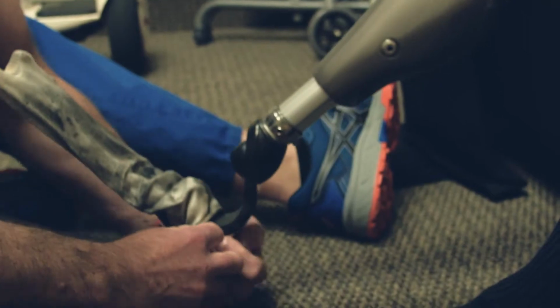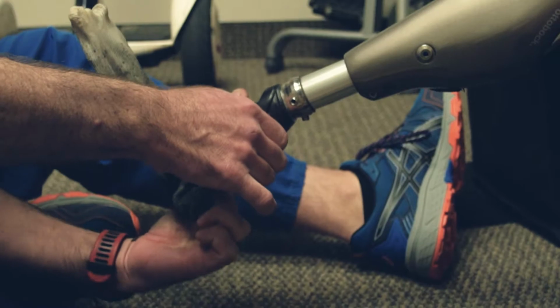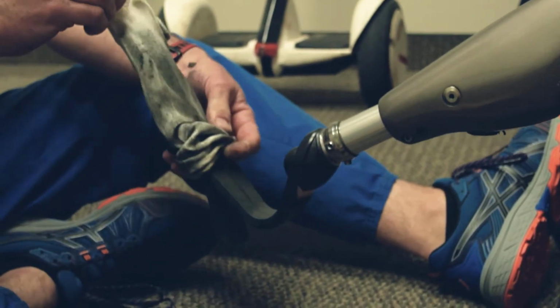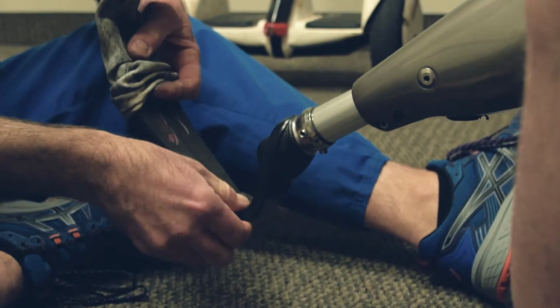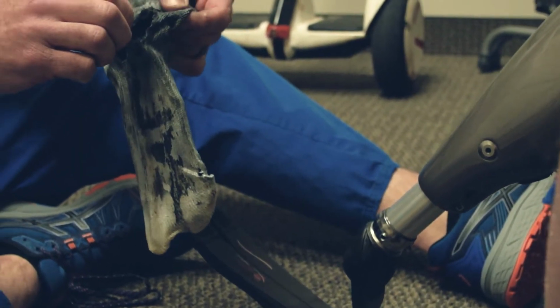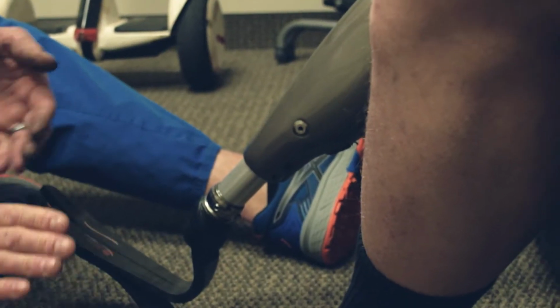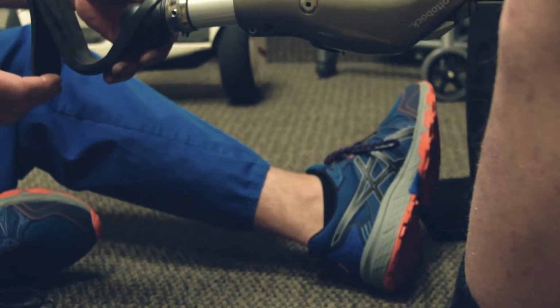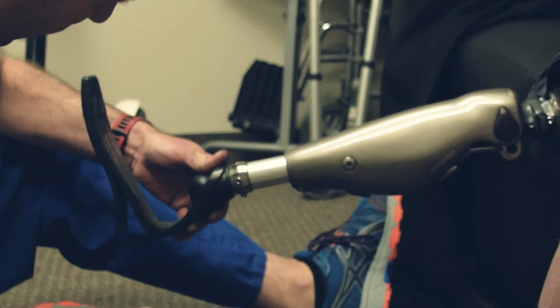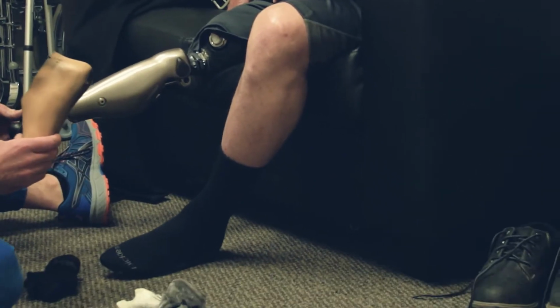Man, my foot's ugly without that foot on there. Yeah, it kind of is. That really looks bionic. Well, this is what we have you in for, to evaluate it. So what you did is you ate through that sock, and then that sock ate through that foot shell, and then the carbon ate through your shoe. Huh, okay. I'm glad you said that. I wouldn't have caught that otherwise. So have you got something to replace that with? Well, what we're going to do is replace the sock, and that'll keep it from eating any further. But this needs to be replaced.